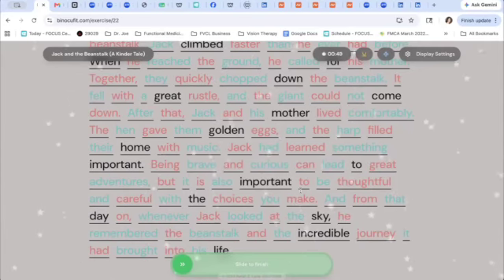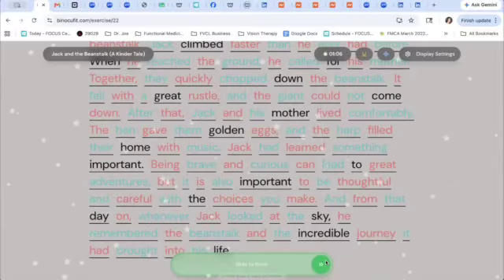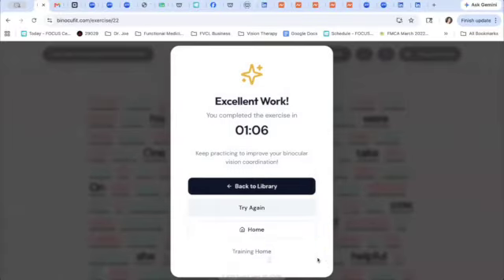Or I've put in news articles for an older patient or an adult to read, which keeps them engaged as they're doing this. In the reading collection, at the end of it, you do have to slide to finish, and then it would pop up those five comprehension questions.